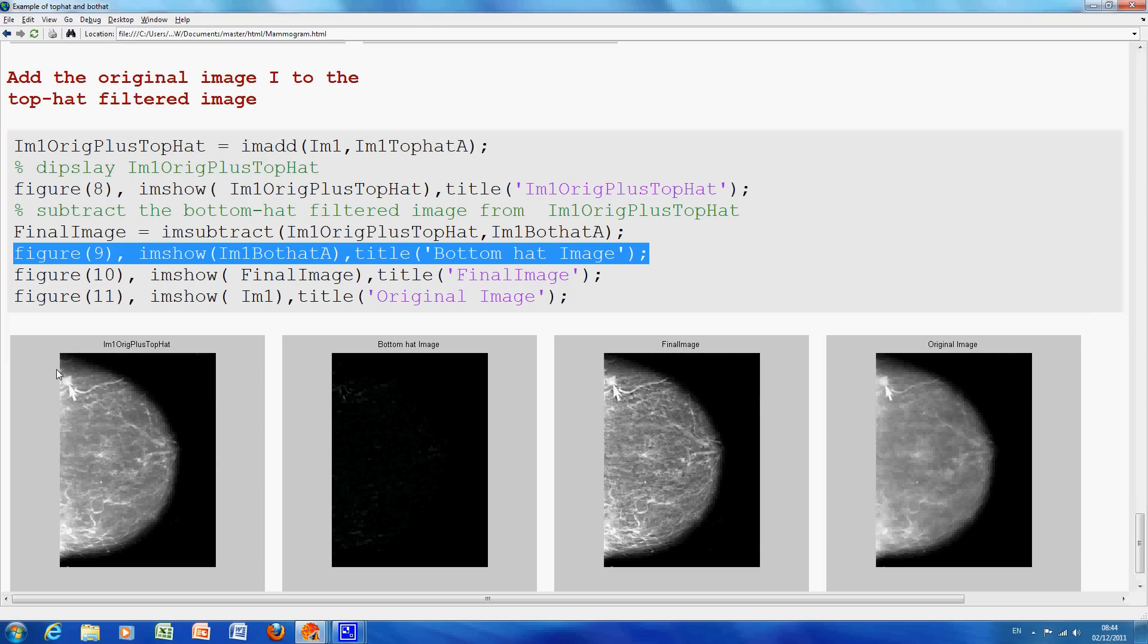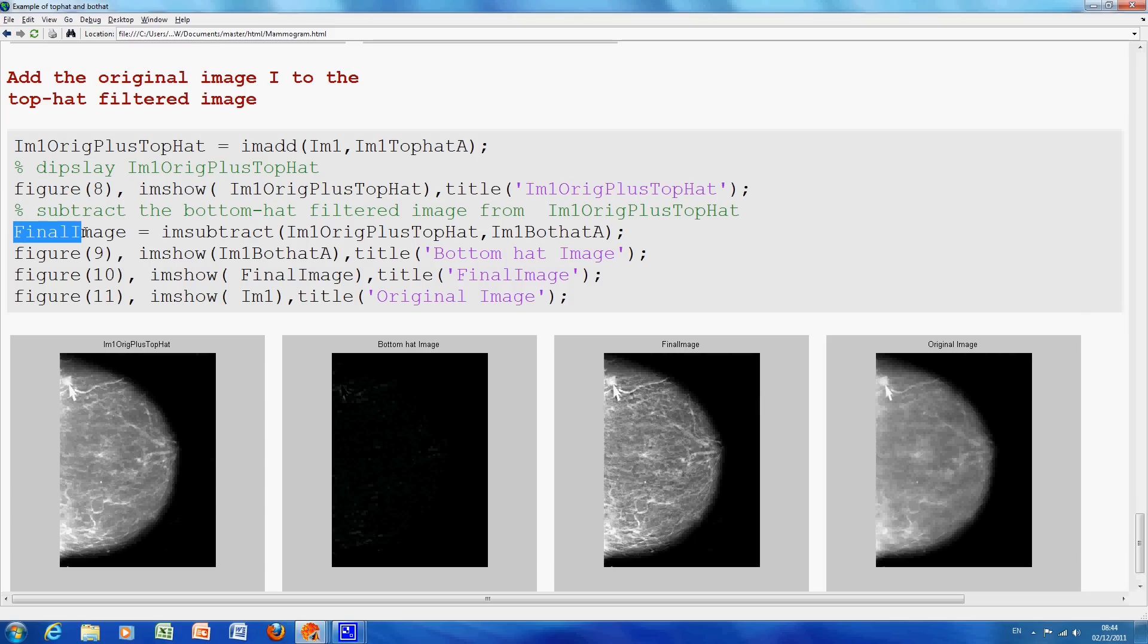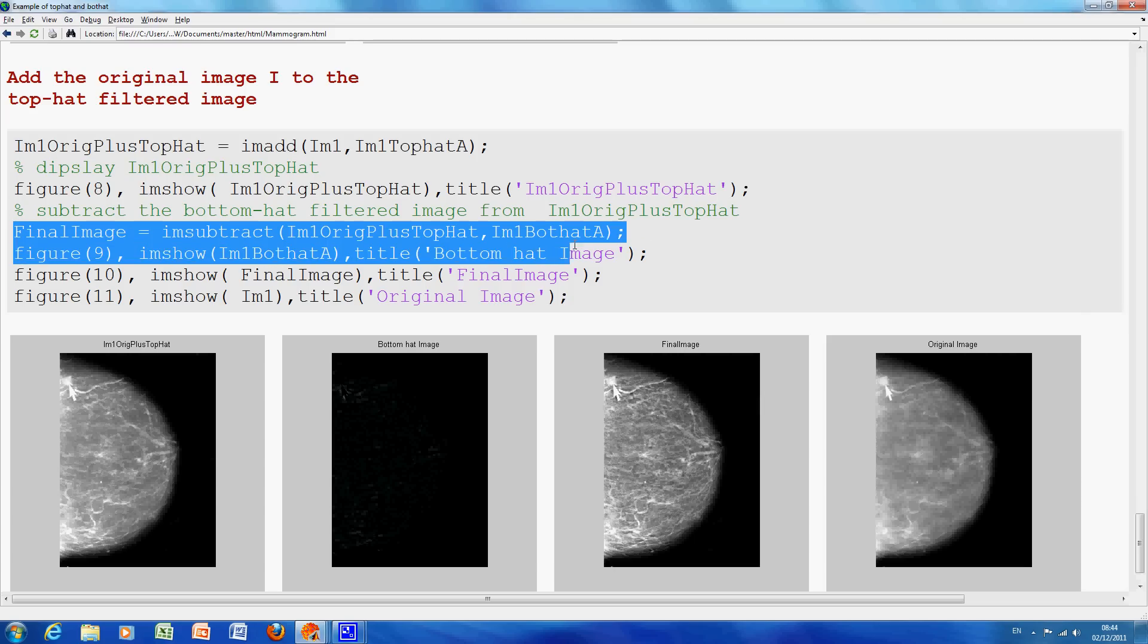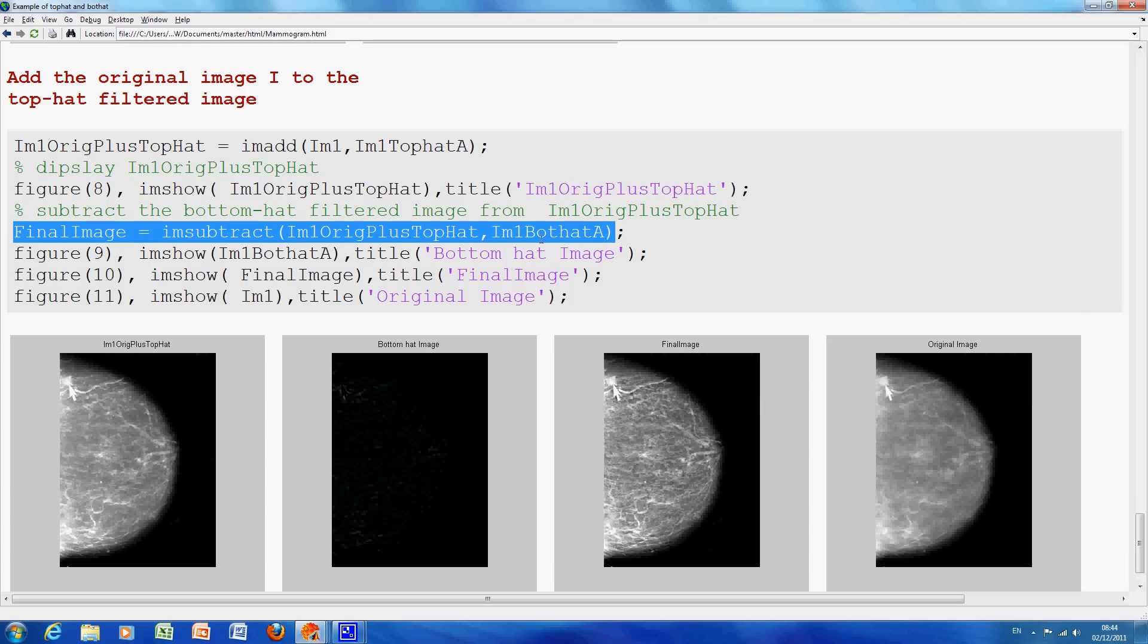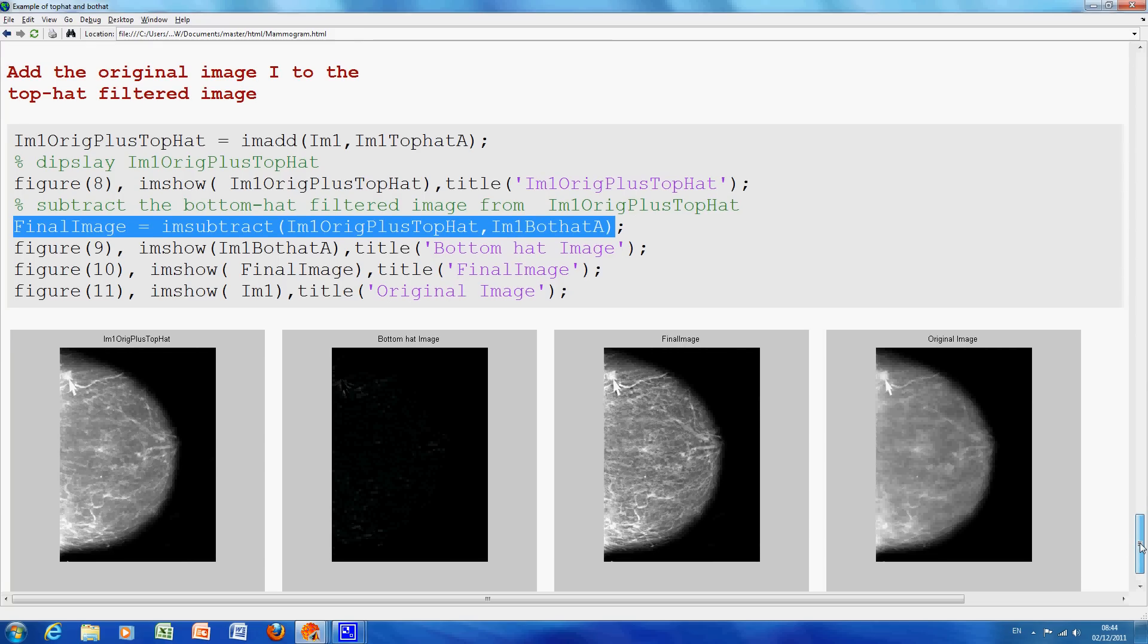So, I know this sounds odd, they are intensity drops, but you're representing them as grayscale values, so you want to take them away, so that's why we said, just to go back to this line here, just a line above it, that line there, you're subtracting the BotHat, so you're taking away values, and when you're taking away values, you're making that particular bit of the image darker.